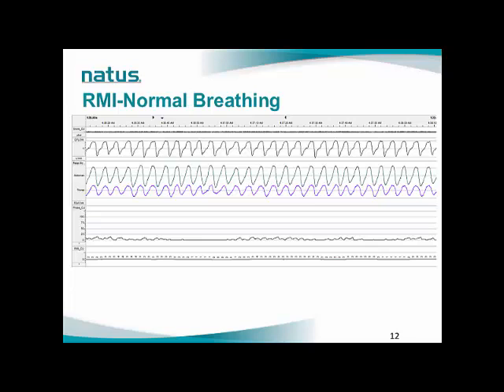Thoracoabdominal effort shows a synchronized breathing pattern. Looking at the phase, we can see that there is no change in the phase signal. Therefore, no RMI events were detected.